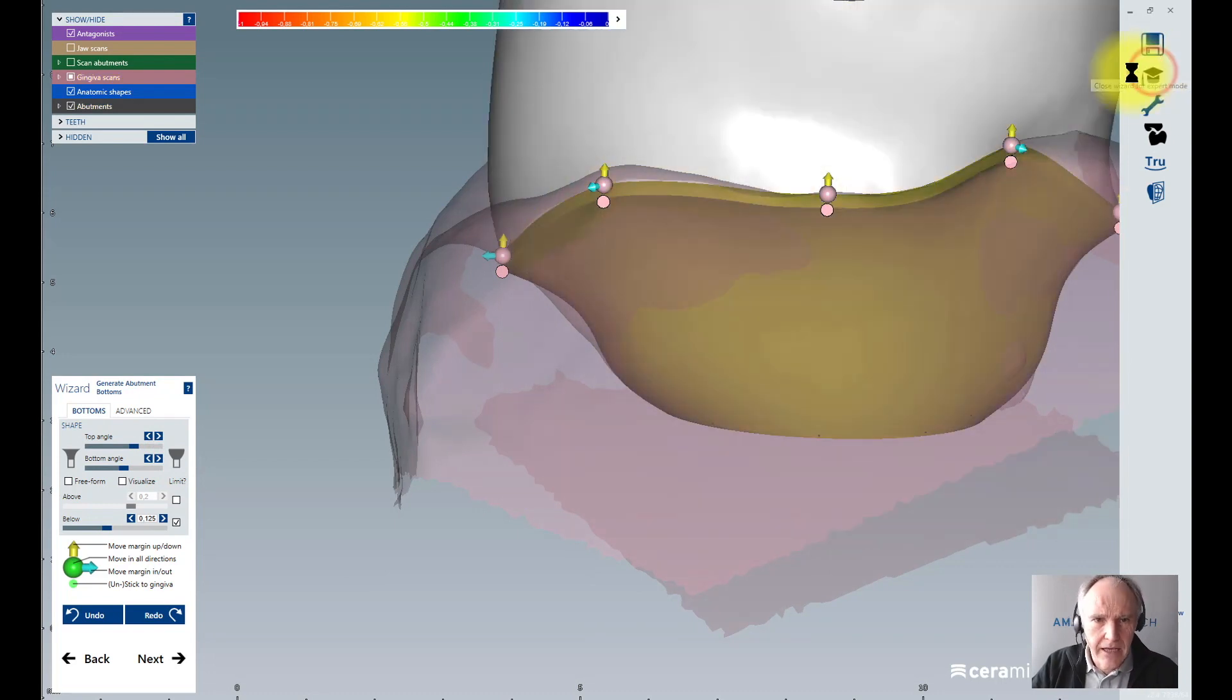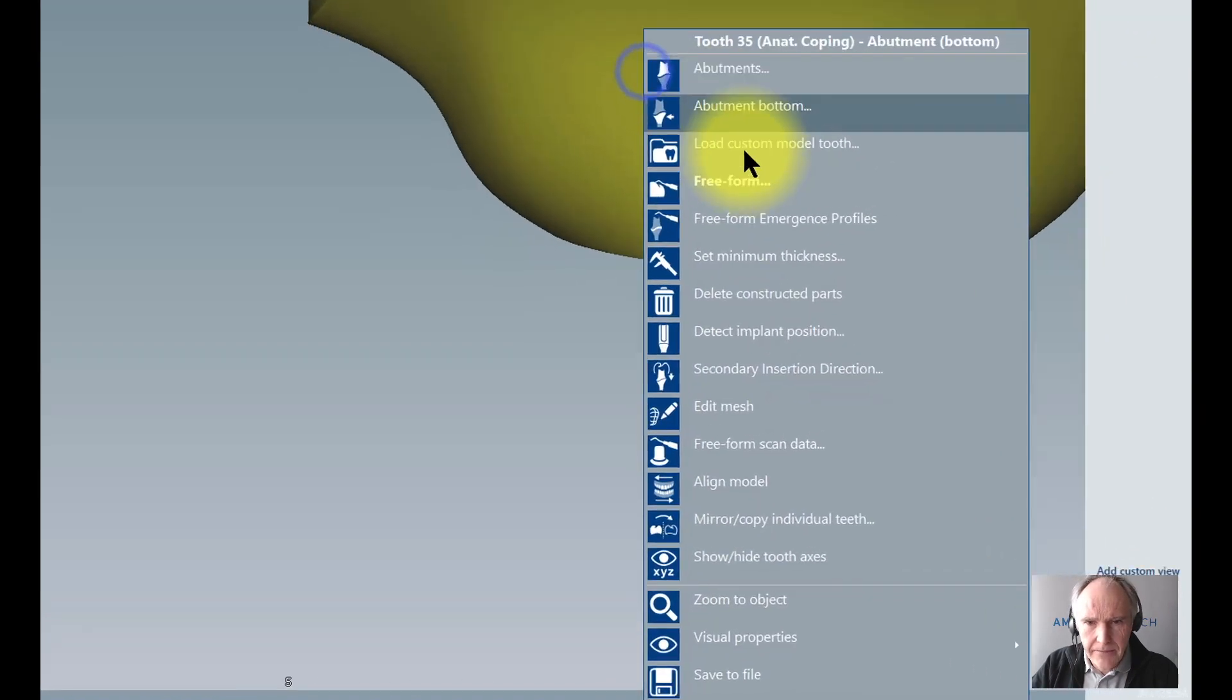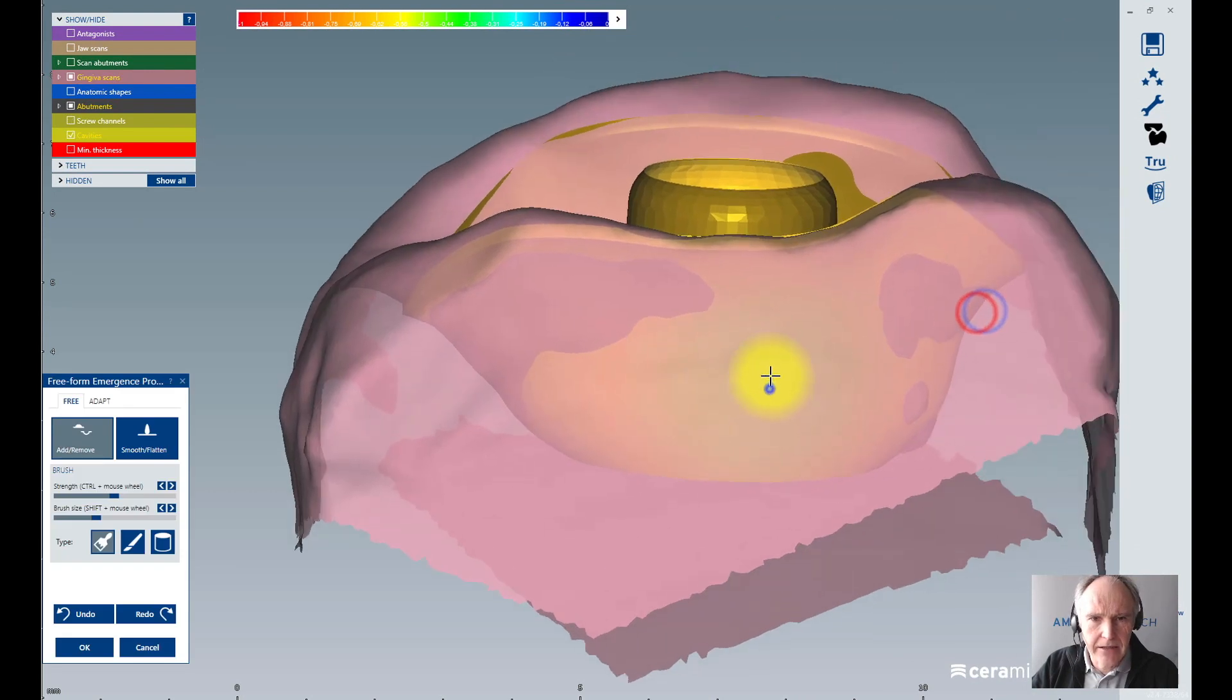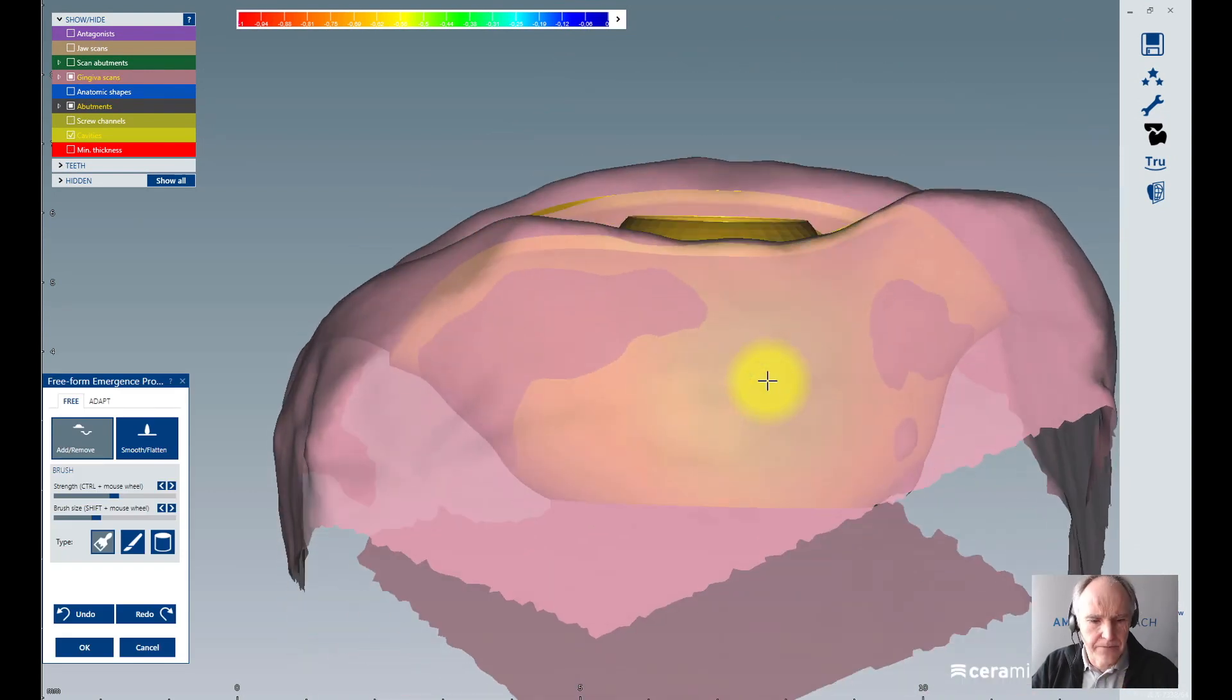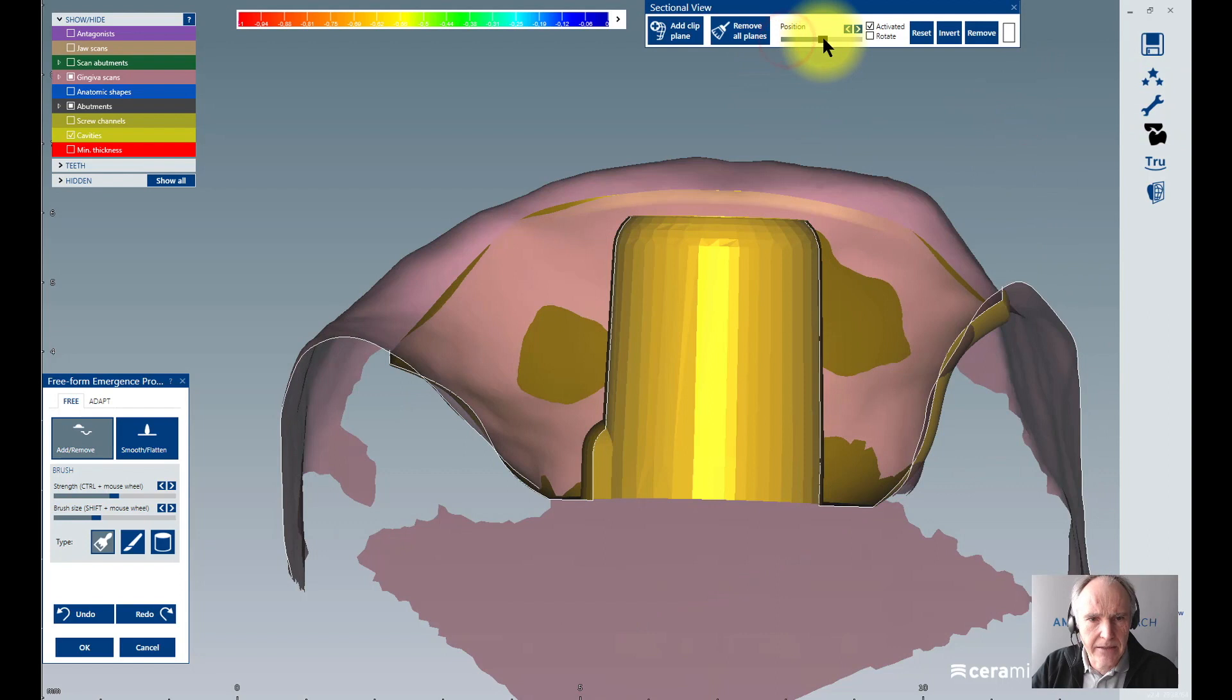You go to the expert mode, and here in expert mode you find a command called freeform emergence profiles. With that profile editing I can make a special cut. To show that a little closer, I go to the expert tool here to the sectional view and I cut my abutment in the middle to show you closer what to do here.